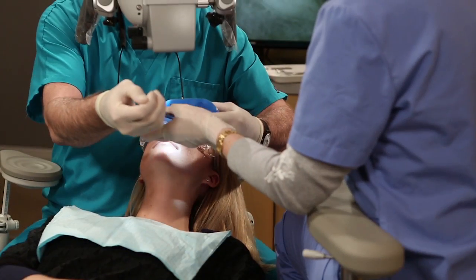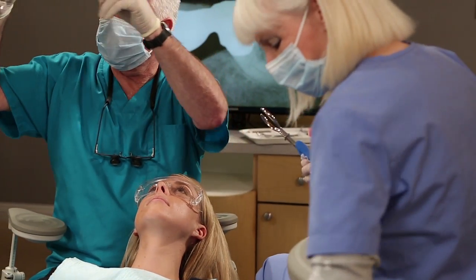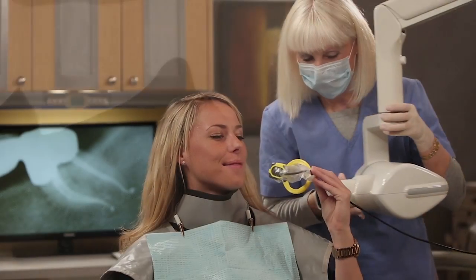I hope you've enjoyed watching this endodontic procedure. We've covered all the steps that comprise start-to-finish endodontics, focusing on shaping canals. To appreciate the postoperative result, let's review the preoperative film. Again, notice the bridge and the orientation of the underlying roots. Appreciate the canals are long, narrow, and highly curved.